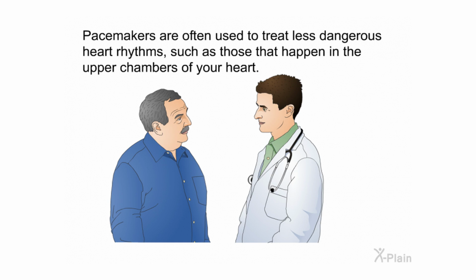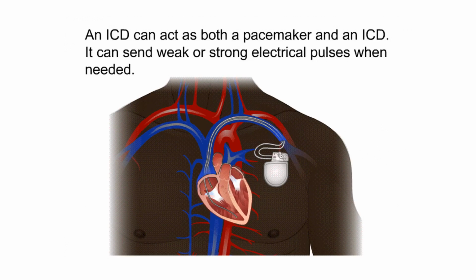Pacemakers are often used to treat less dangerous heart rhythms, such as those that happen in the upper chambers of your heart. An ICD can act as both a pacemaker and an ICD. They can send weak or strong electrical pulses when needed.